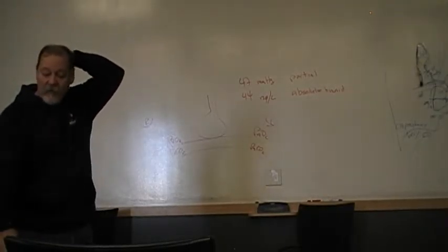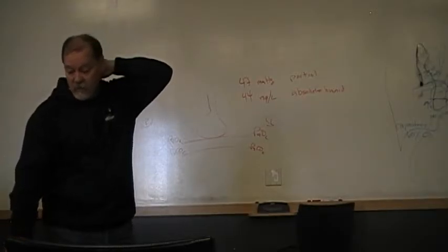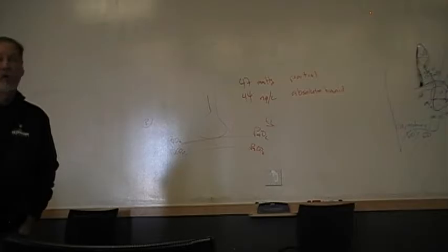So we can tell if this catheter is in the pulmonary artery by the waveform analysis, representing pulmonary pressure on systole of 25 and on diastole at 12. It means that the pulmonic valve has closed and now there's resistance of blood flow throughout all of the lung fields.